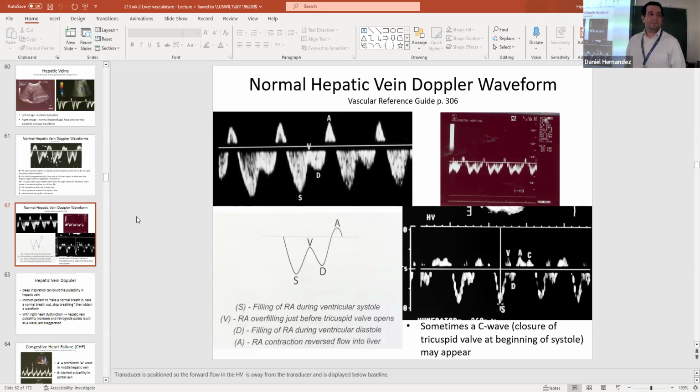Do you Doppler each hepatic vein? Upside down bunny. Yeah, we do Doppler. As part of the liver study, yeah, you would Doppler all three of them, and they should all look like that. It's going to vary a little bit because of Doppler angles, since the veins are not lined up at like 60 degrees or anything like that. But they should have the same general appearance. Should be away from the liver, draining the liver.